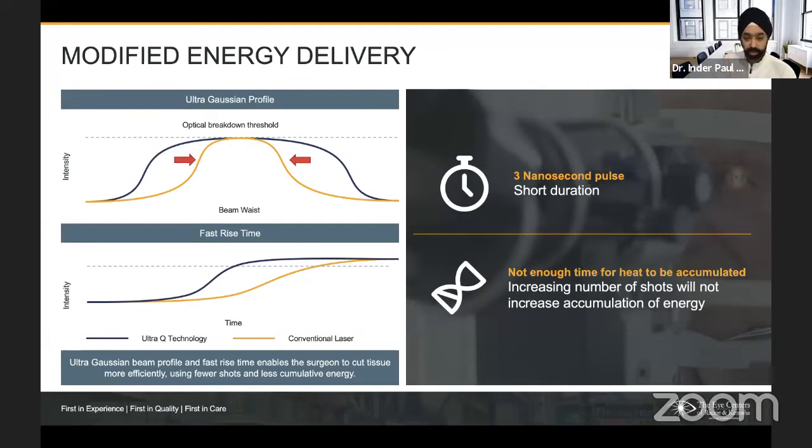Sure. Well, I can tell you that in the data we published, we've gone up to 1,000 shots at 6 millijoules. We have done some studies using something called the ADAPT-DX, which looks at rod functionality and retina function. We've done over 2-year data following different ranges of number of shots and energy levels, and we have found no degradation of retinal function. So I don't have a perfect number to give you. I will tell you the adverse events: I have seen some patients develop IOP spikes, pressure spikes.